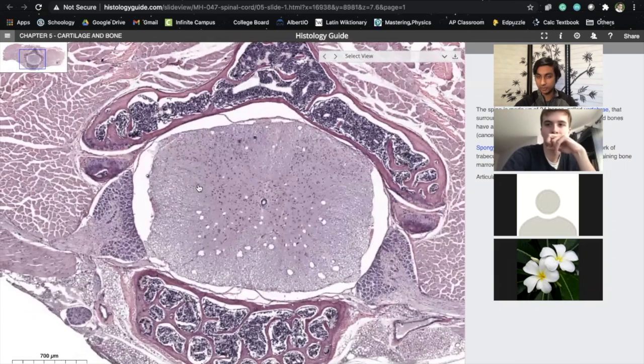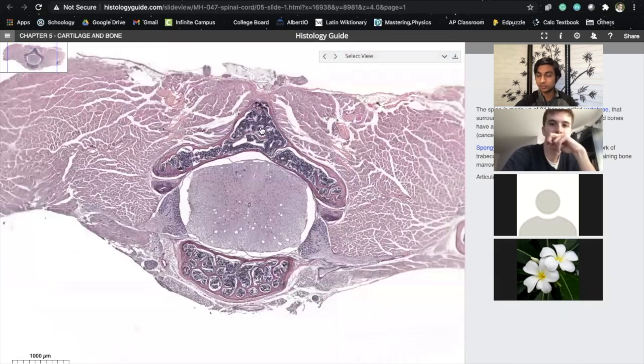So this is a spinal cord, and surrounding the spinal cord is, what do you think? If you're taking a cross section, maybe for those of you who saw the CT scans from a previous meeting, what would surround on both sides? We even talked about this at the last meeting with neurology. Okay, it's the vertebrae. It's the vertebrae surrounding the spinal cord, which protects it, as I'm sure you know.